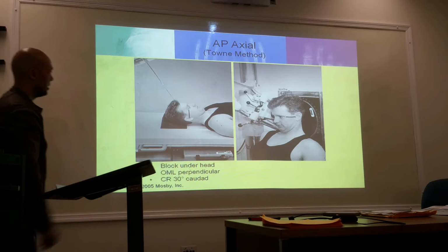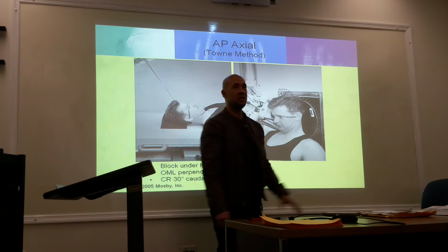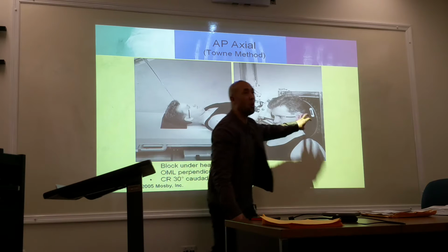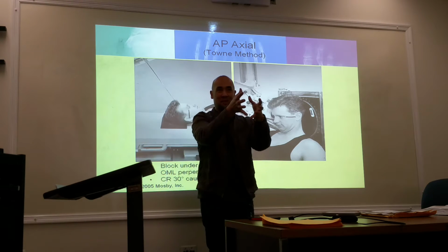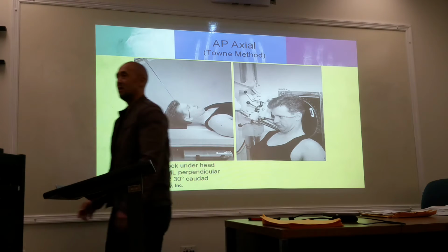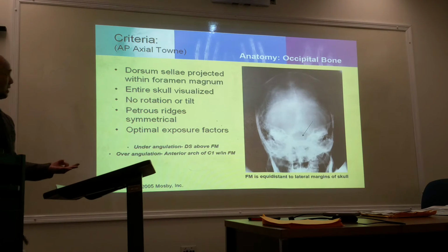Looks like the same thing. Okay, so the same thing here. So extreme chin tuck, this is what's called the Franklin head unit. It's done on an upright board, and there is a hole in the back where you can go behind the head unit and adjust the patient's head accordingly. Yeah, this is right behind the unit. Okay. So again, 30 degrees for OML, 37 for the IOML. And it looks exactly like this, okay?